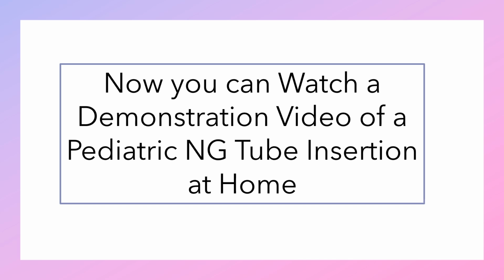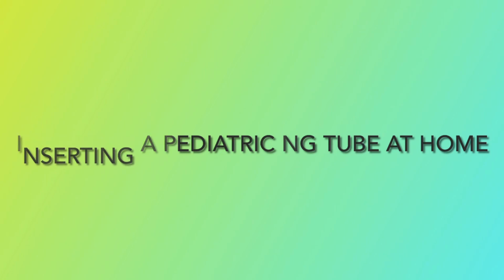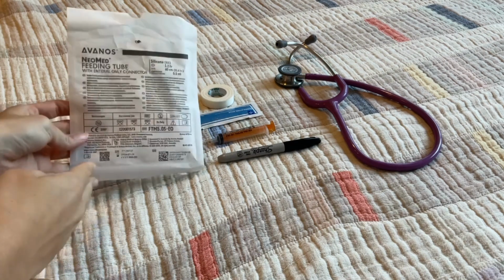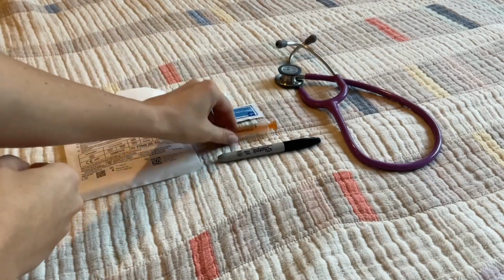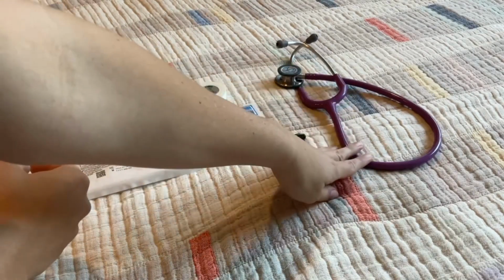Now you can watch a demonstration video of a pediatric NG tube insertion at home. The first thing you're going to want to do is gather your supplies. You'll need an NG tube, some tape, some lubrication, a syringe, a Sharpie, and a stethoscope.